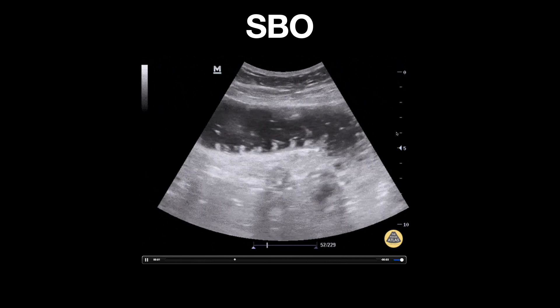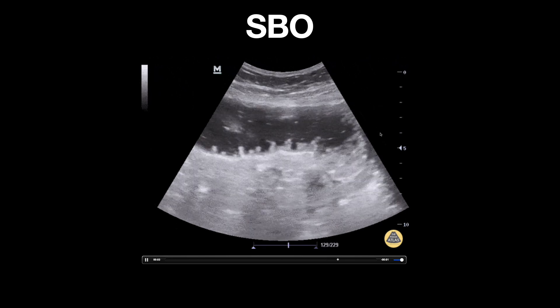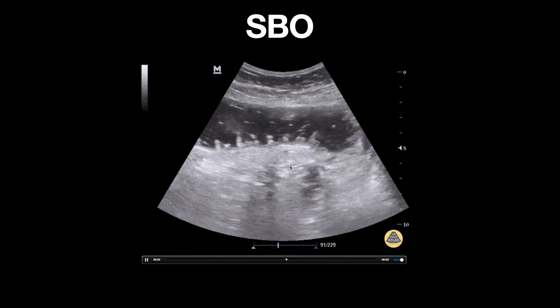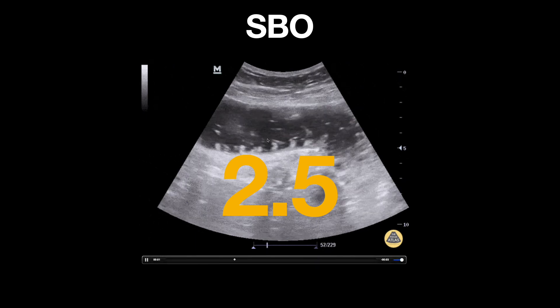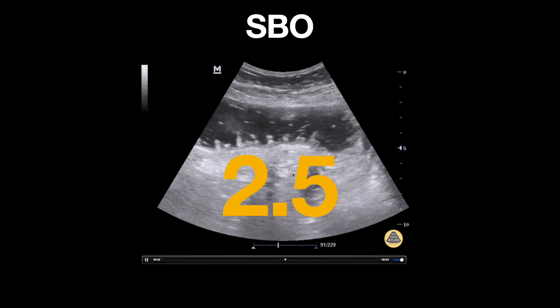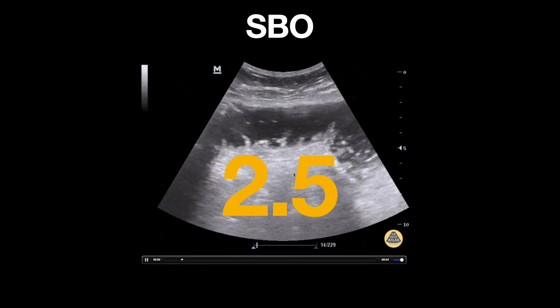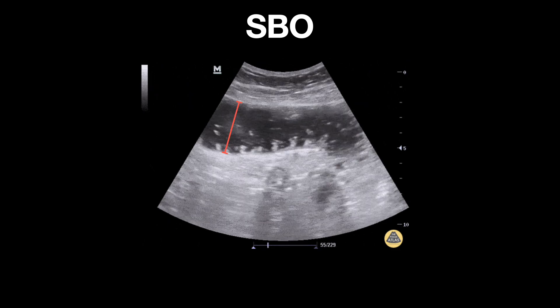Several findings in this clip clue us in that this is a small bowel obstruction. First, we can see that the small bowel is dilated. Remember 2.5 centimeters — this is the cutoff of normal bowel size. You should measure perpendicular to the lumen of the small bowel when evaluating from wall to wall.